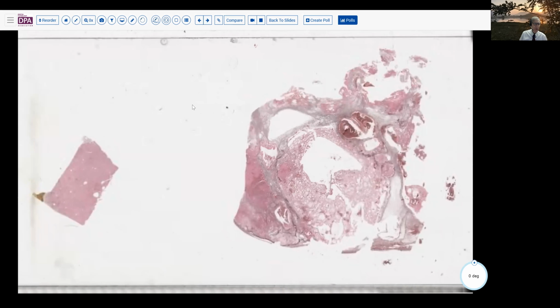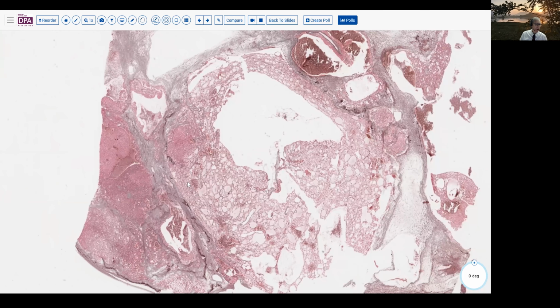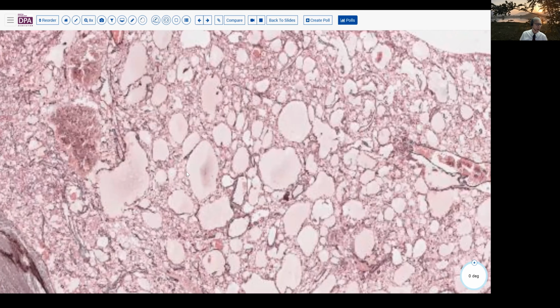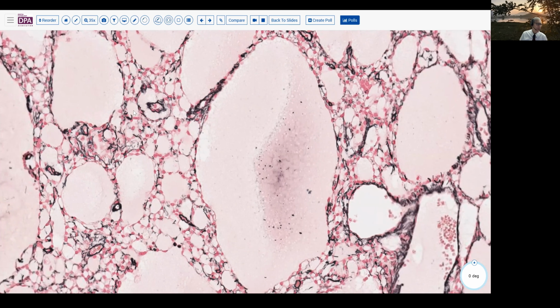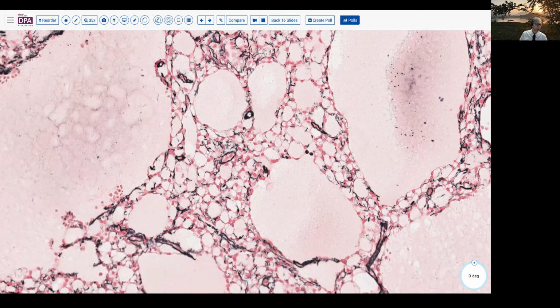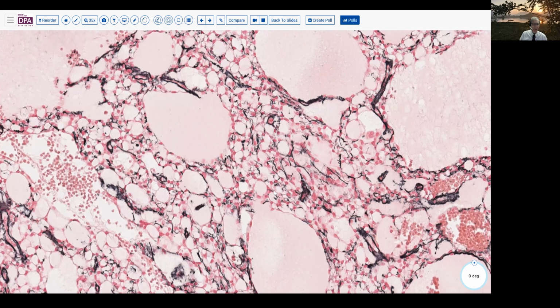One of the things we wondered about was granulosa cell tumor. And so we did a reticulin stain to see if that might be helpful to us. I think you can see here that there is reticulin in this, but the reticulin is not particularly highlighting nests of cells. It's just scattered, haphazard. It's not around every cell, as might usually be seen with granulosa cell tumor. It's not highlighting any evidence of particular epithelial type origin. It's really much more haphazard, here some, there some.